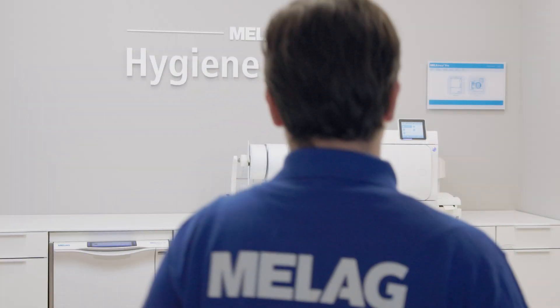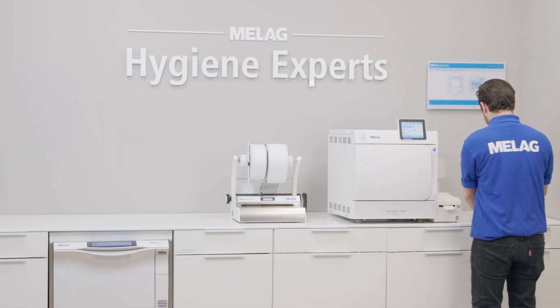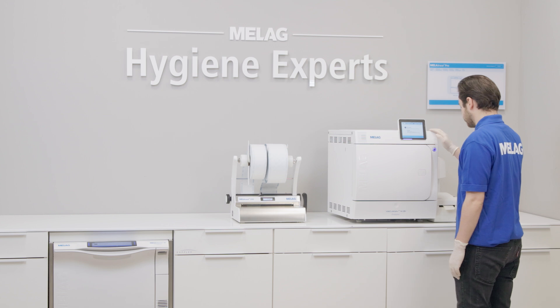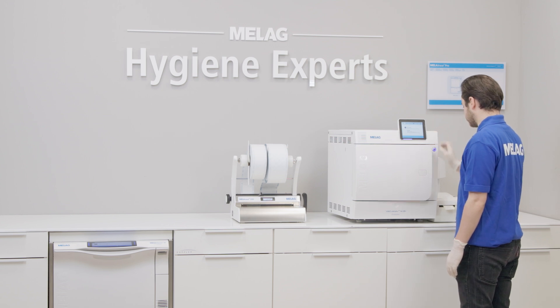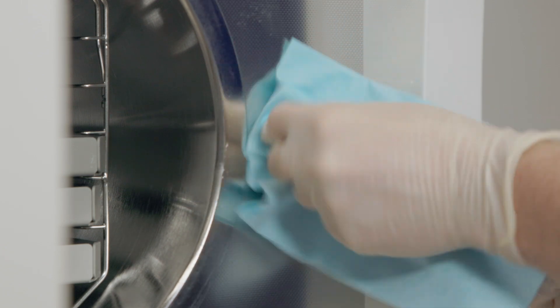Our premium plus class steam sterilizers — Vacuclave 550, Clinicclave 45, and our foreign one solution Careclave — are equipped with an automatic door lock. In this video tutorial, we will explain how to check and lubricate it every two months.